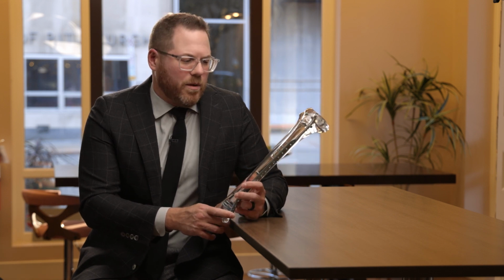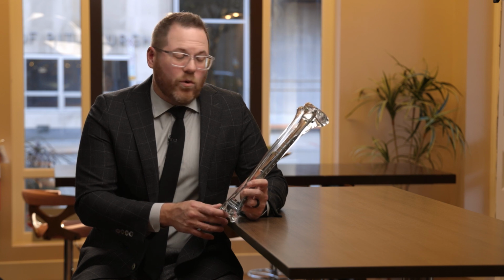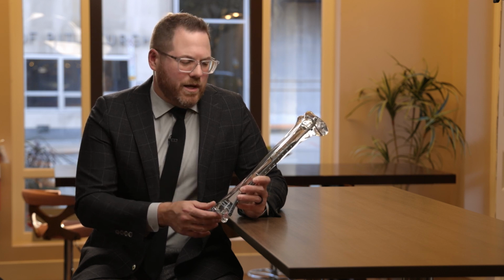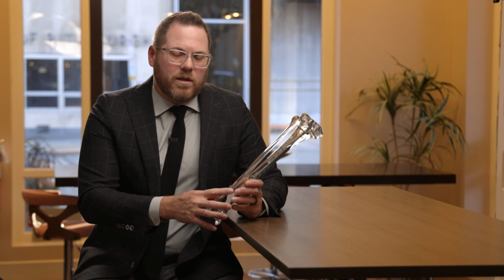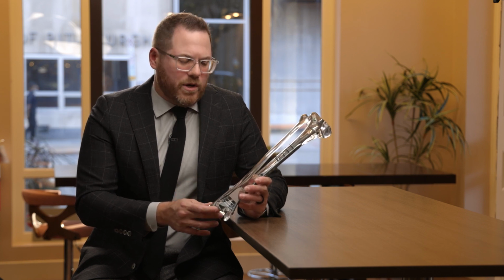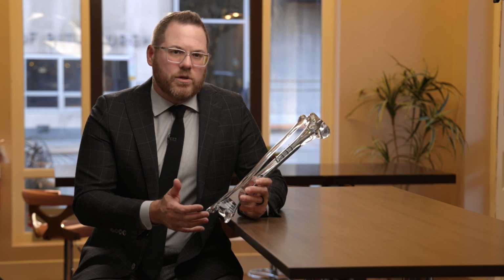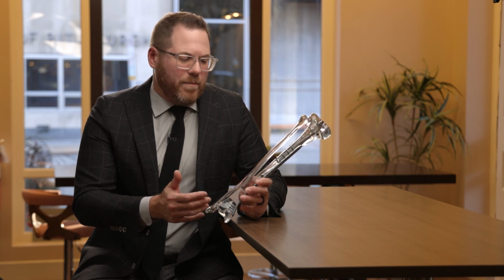As I'm planning for a PABST case in this tibia, for example, it's important to have full-length films of the tibia that are calibrated in order to get an accurate length of the tibia. This can also be gleaned from CT scan data, and for these cases we most often have a CT scan. We're looking at length as well as the diameter of the intramedullary canal, and this is important for both the plate application as well as the intramedullary nail application.